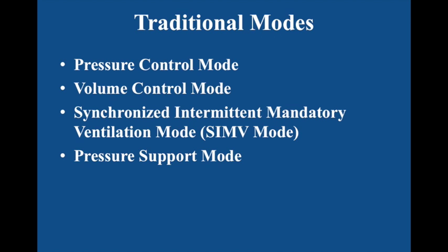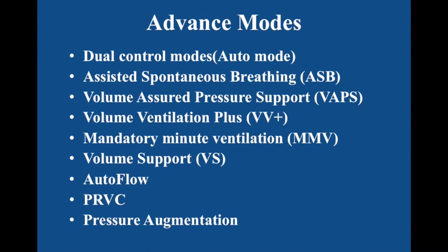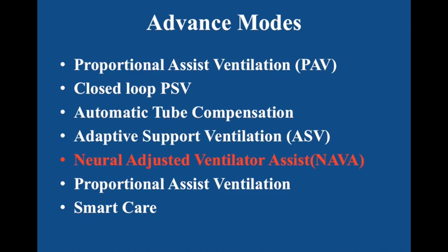For the traditional modes, I believe you all feel comfortable using them in the clinical setting, like pressure control, volume control, SIMV, and pressure support mode. And there are a lot of advanced modes nowadays, like dual control, ASB, VAPS, VV+, MMV, volume support, auto flow, PRVC, and patient pressure augmentation.